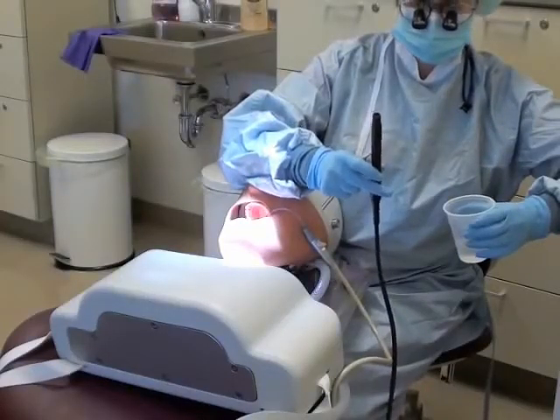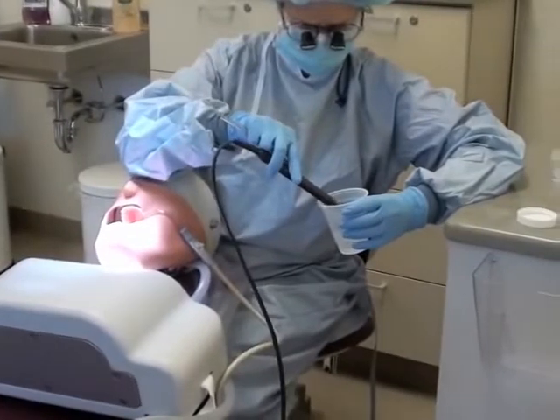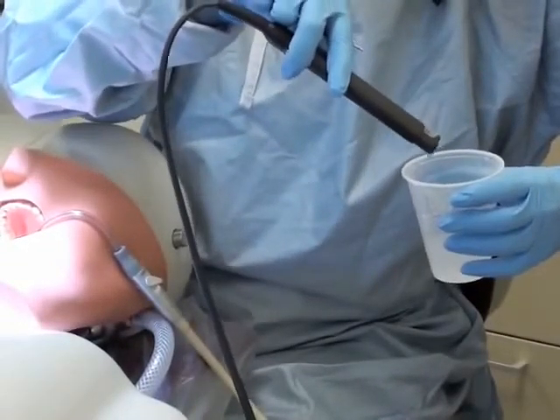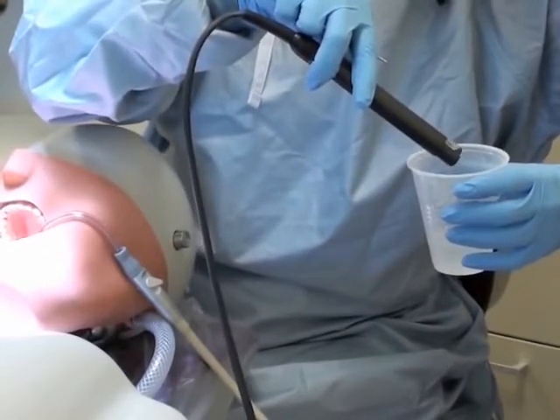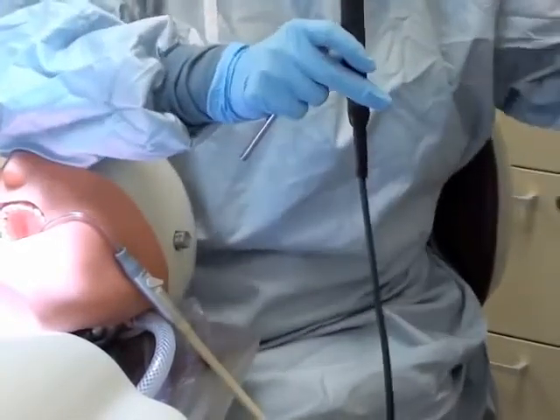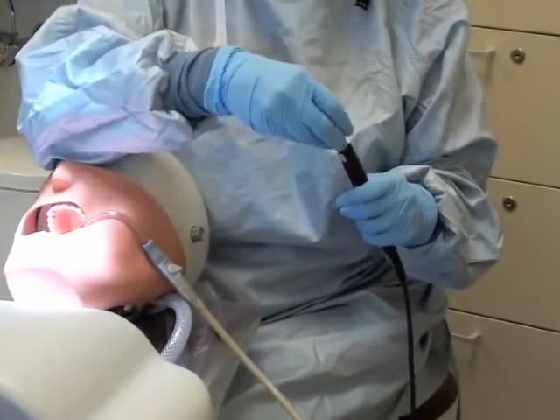The insert is similar to the ultrasonic for the ProfiJet or air polisher, and you're going to want to purge this line as well until you get the water drips out of it. You're going to want to make sure that this purges for at least 30 seconds. After 30 seconds has elapsed, you want to fill up your chamber and place your tip in.